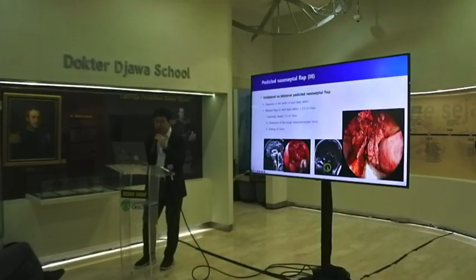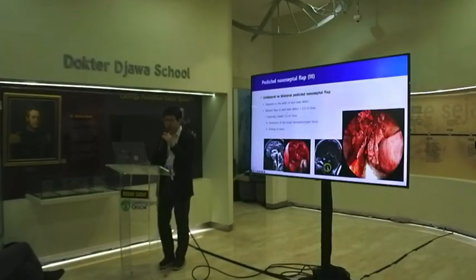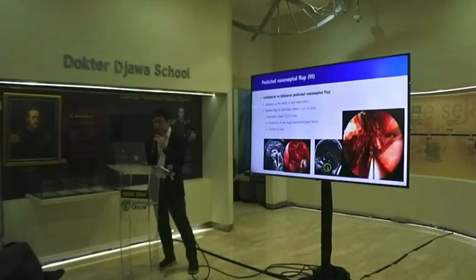And this is the unilateral or bilateral pedicled nasal septal flap. It depends on the width of the skull base defect. Bilateral flaps are needed when more than two-thirds of the clivus is exposed; you should better prepare the bilateral pedicled nasal septal flap.